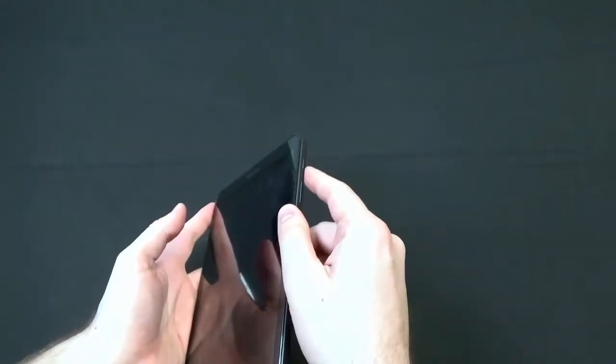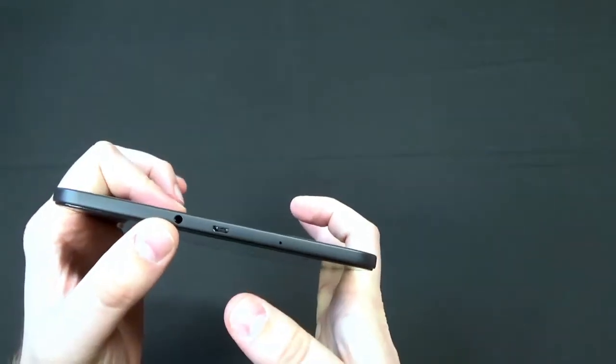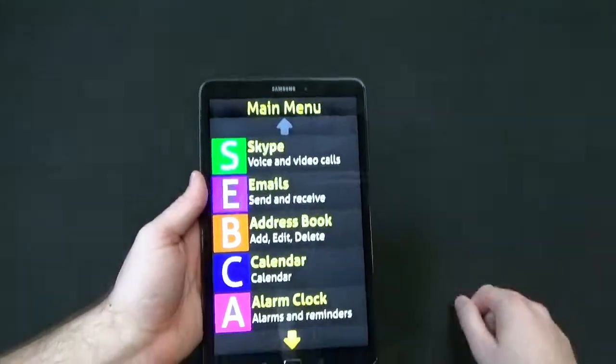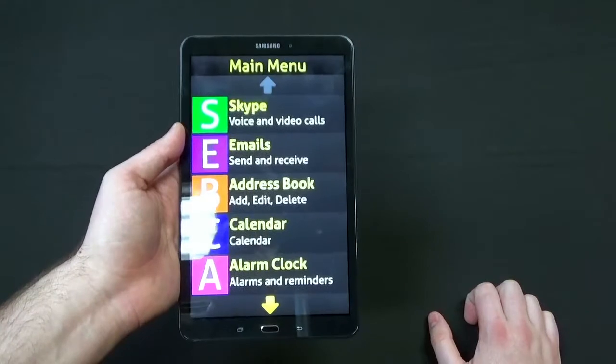Let's go ahead and turn it on. On the side we have a power button and volume. On the top you have a charging port, headphone jack, and a little mic. On the bottom we have some speakers and a back button and home button for our Android buttons. Here is our Synaptic tablet and our Synaptic user interface.